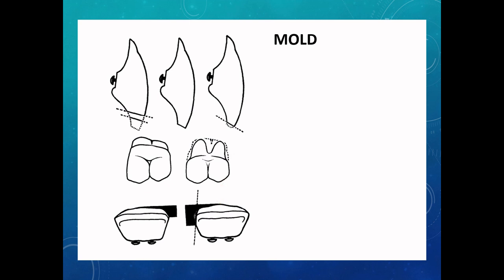So depth perception is actually limited in the artificial tooth because the contact point is too near to the labial surface. So here you can see it is too near to the labial surface. So here depth perception has been increased by depth grinding, that is a cut made on the labial mesial line angle of the artificial tooth. And also the personality mold selection.